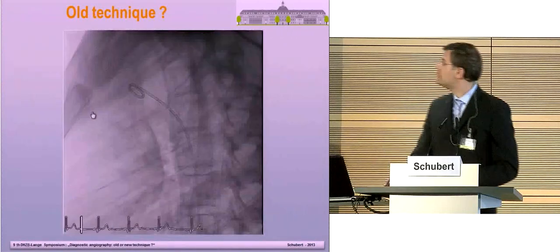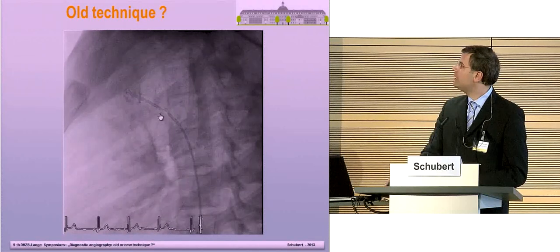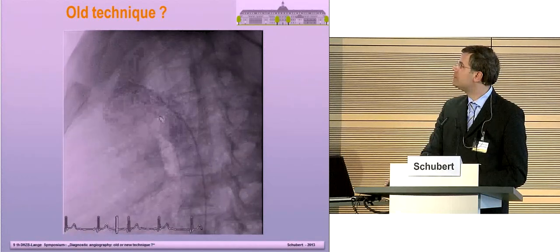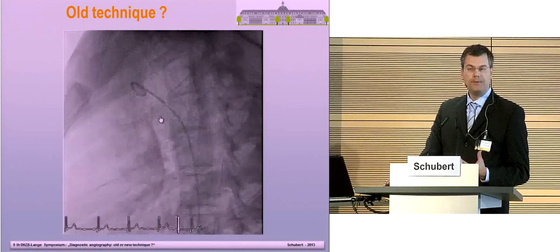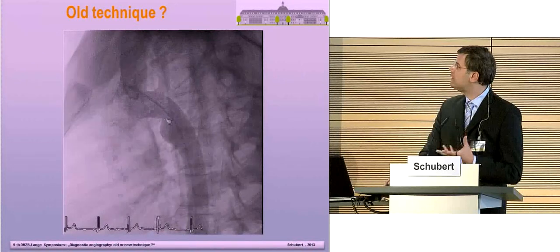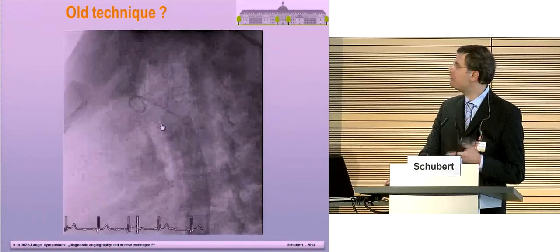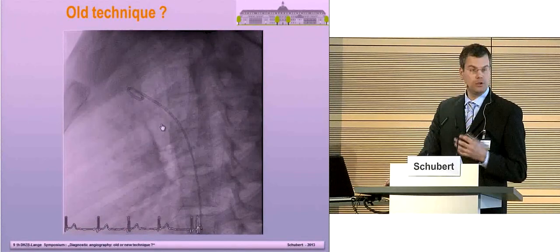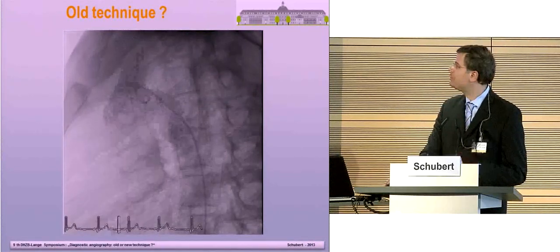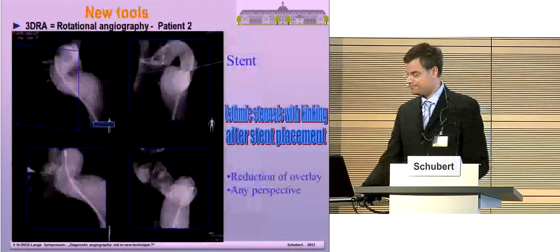And in this patient, this is the lateral projection only. I think in the beginning we would say the judgment of this region might be more important as it looks in 3D. I would say that this is the impression which I get from the angio. Would I say this is quite a narrowing, but there was not a real gradient. This is confirming this, and the 3D, I think it's giving us some good additional information.